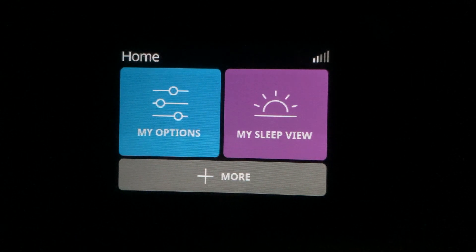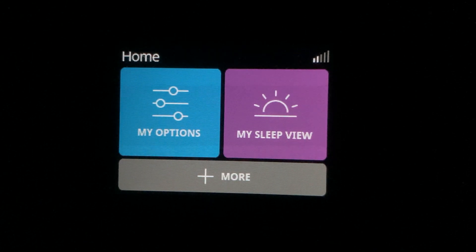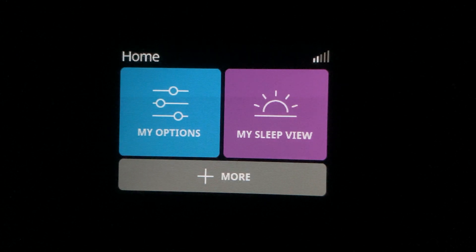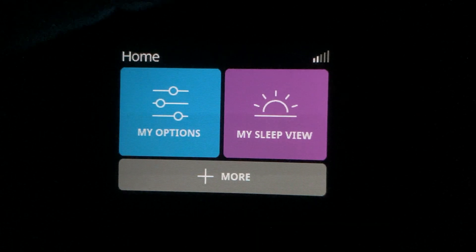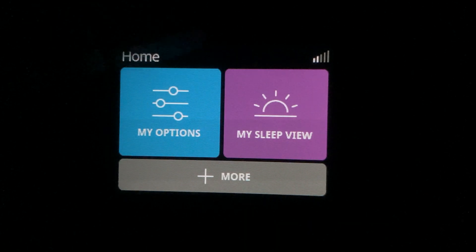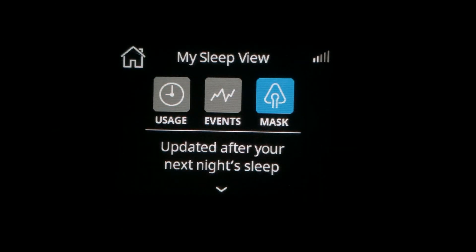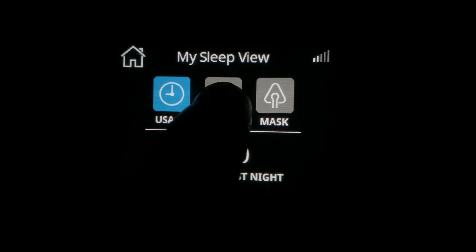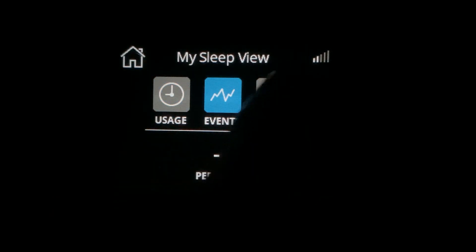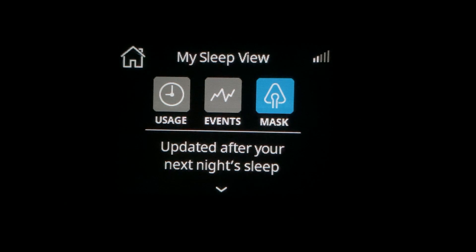In this video I would like to show you how to find your leak information on your machine. I'm going to find this by going into My Sleep View — there are three different options in My Sleep View. I'm going to choose the option for mask.